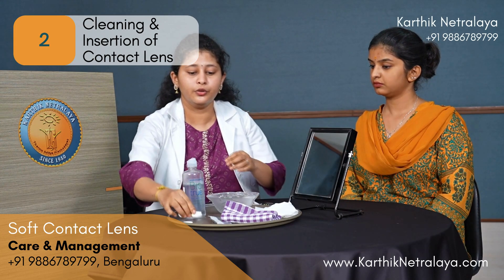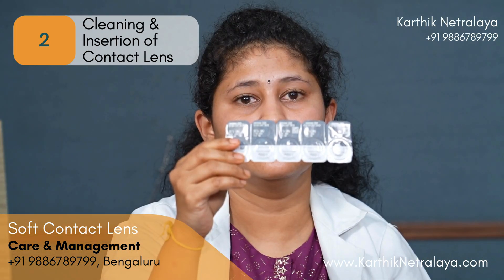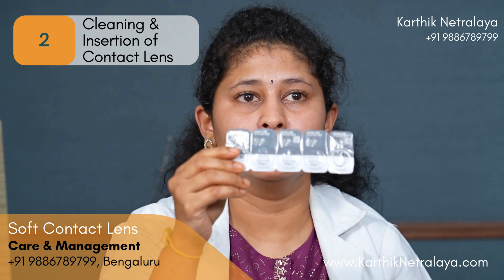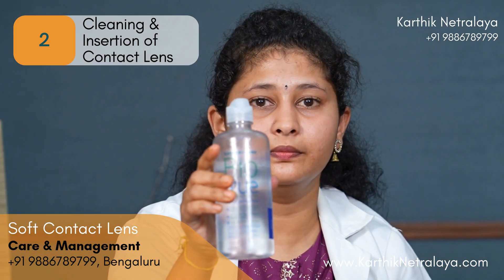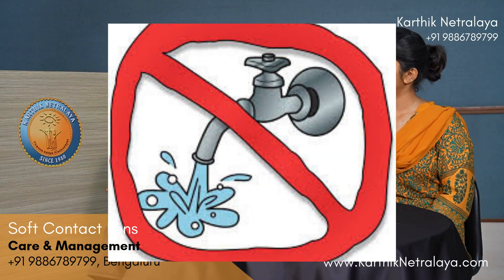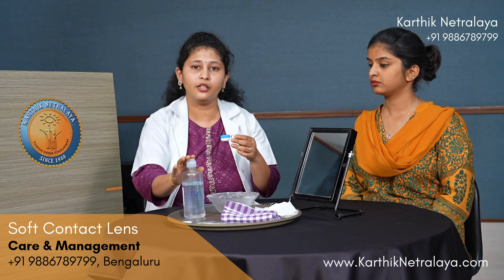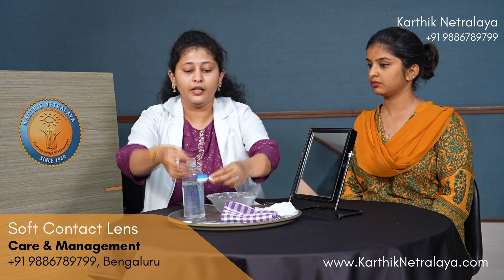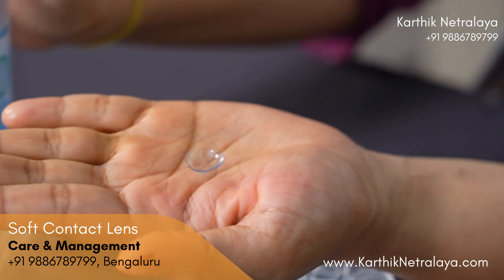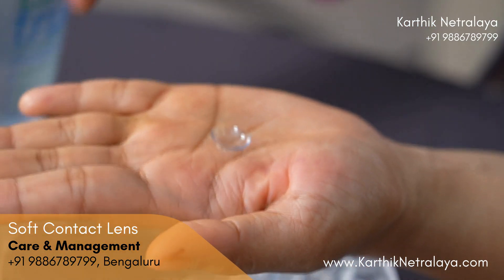You will receive the contact lenses in a blister pack. Once you open it, you will have to store them in the contact lens case. Use only the contact lens solution — you should not use water to store or clean the lenses. Only solution has to be used. The contact lenses are now in the case, and I am taking them out.